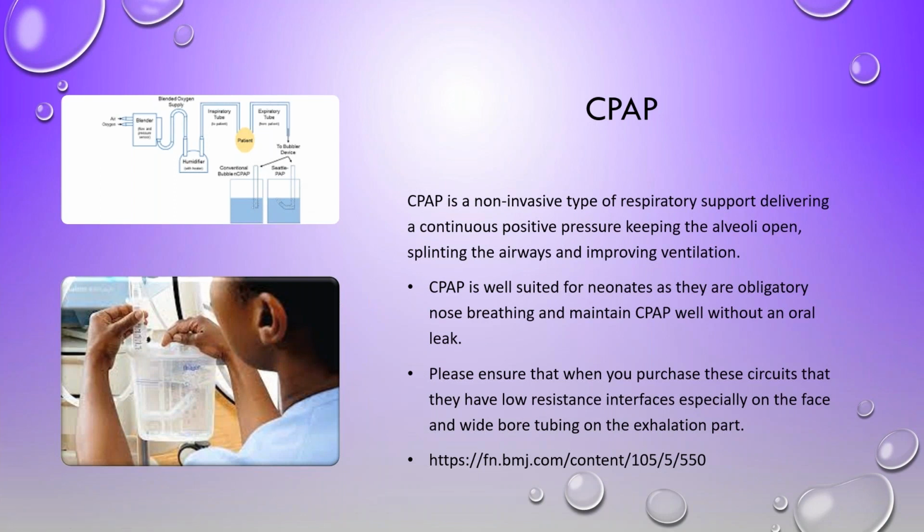The nice part about the Seattle PAP is this almost C-like curve here. So this is conventional bubble PAP. This diameter is very important to create the bubbles. But with the Seattle PAP, and you can see it there, that curve actually improves the situation as well.